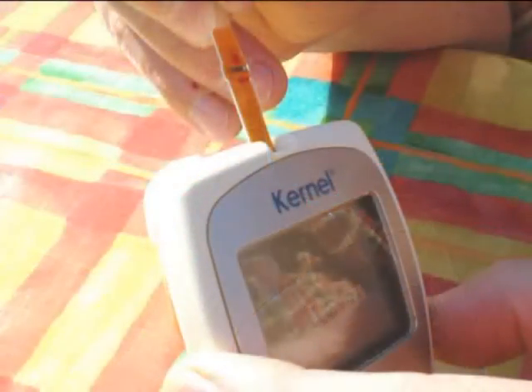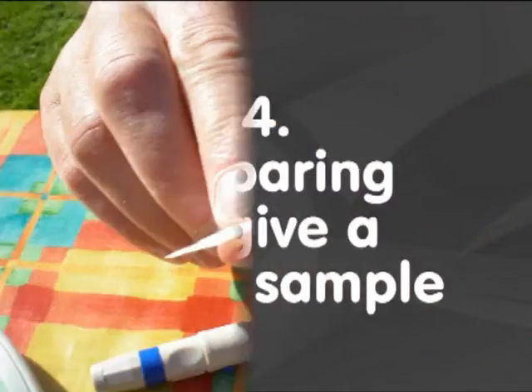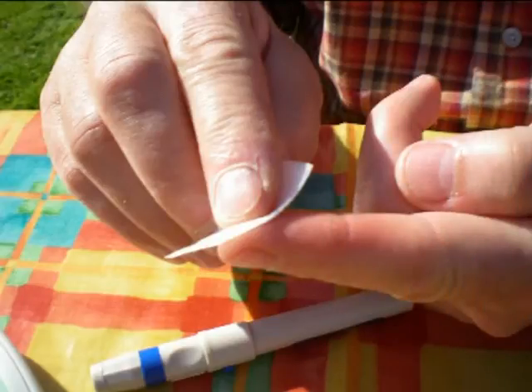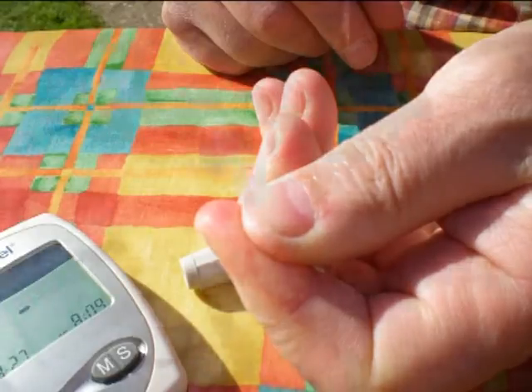Once it is inserted fully, the meter will first display the code number, then the blood symbol along with the date. To get the blood, you first need to clean your finger with an alcohol swab. You can use any finger for this test, and we recommend that if you test regularly, to alternate the finger you use. Once your finger has dried from the swab, you can then take the test. Before you prick your finger, shake your hand to get the blood to the end of your finger. Then gently massage it so it goes a nice bright red.